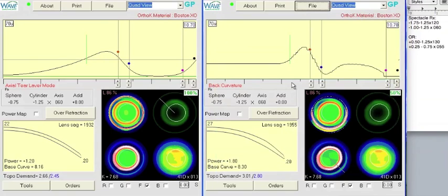So in either case, these are two options. Hopefully the ideas we discussed are helpful and may have spurred you on to some ideas of your own. Both of them, like I said earlier, the prognosis for success, I think, is quite guarded. It's going to require some fair amount of patient education, and perhaps the best solution for this patient could be just part-time glasses for near work.